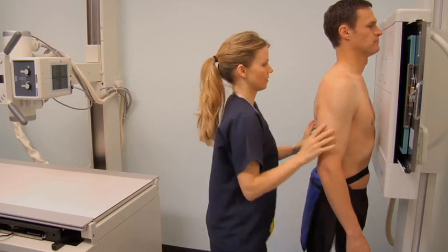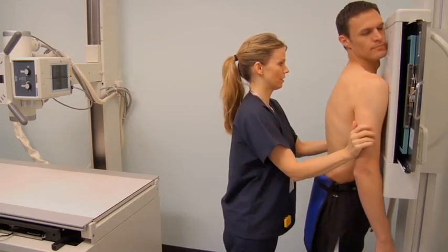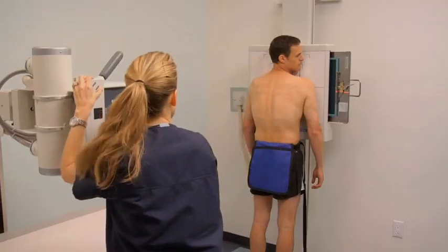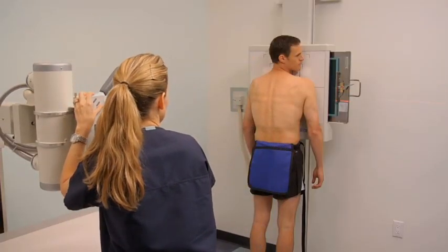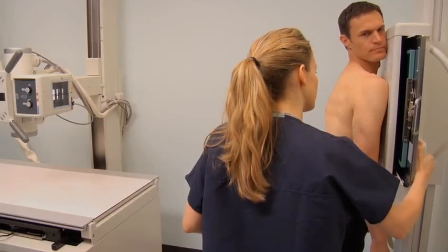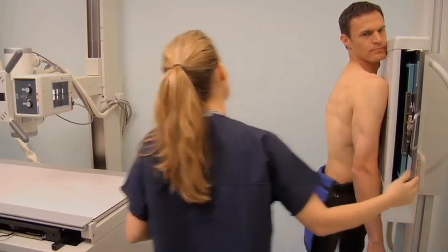Ask the patient to stand with the front of their chest touching the image receptor, IR, and their shoulders rolled forward. Align the central ray to the level of the 7th thoracic vertebra in the mid-sagittal plane, or MSP, and then align the IR to the central ray.